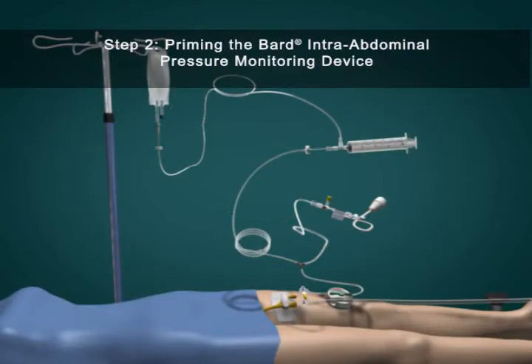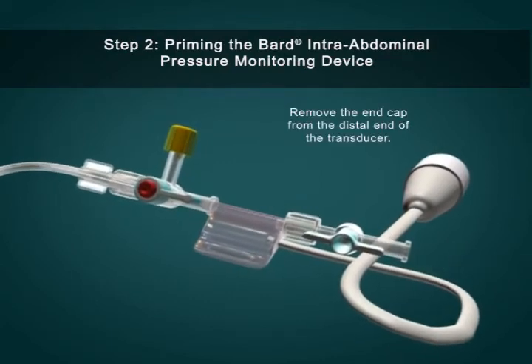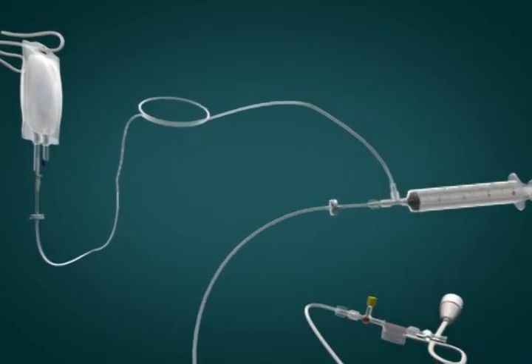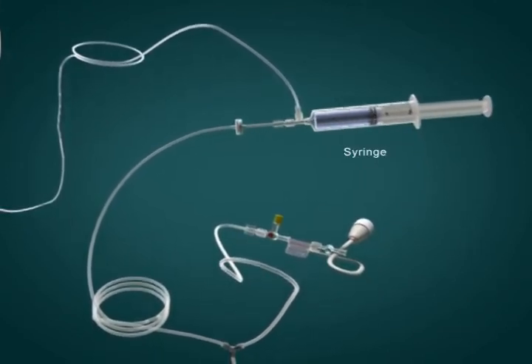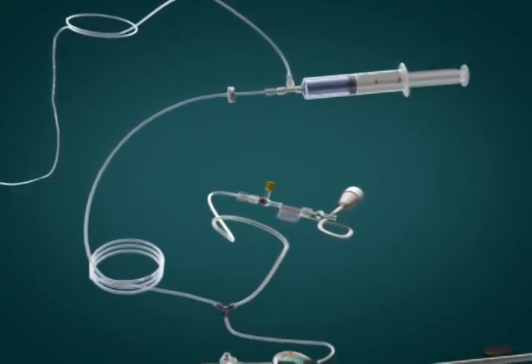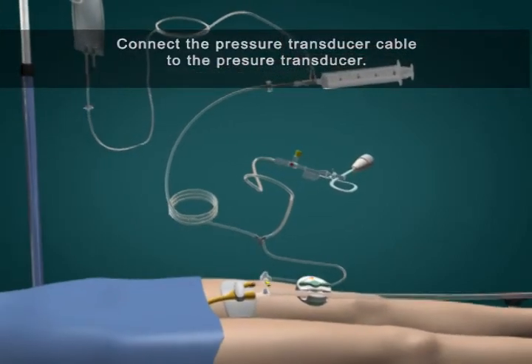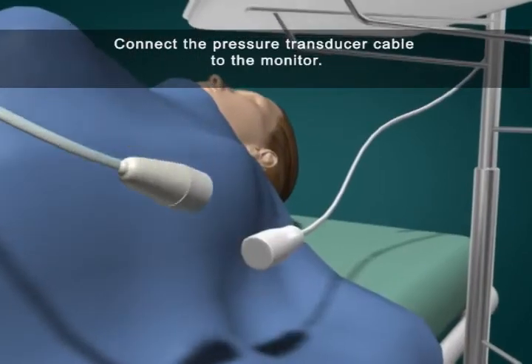Step 2: Priming the Bard intra-abdominal pressure monitoring device. Remove the end cap from the distal end of the transducer and open the transducer stopcock. Aspirate approximately 30 milliliters of saline into the syringe and compress the syringe. Observe fluid passing through the distal end of the transducer. Ensure no air bubbles remain in the tubing to the transducer. Close the distal transducer stopcock. Connect the pressure transducer cable to the pressure transducer, attach the transducer to the patient or the pole, and connect the cable to the monitor.